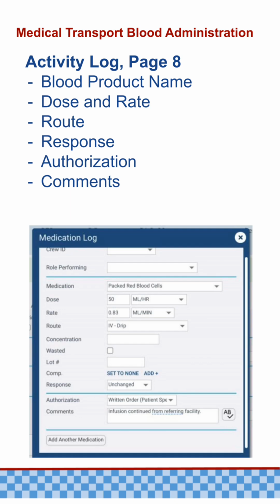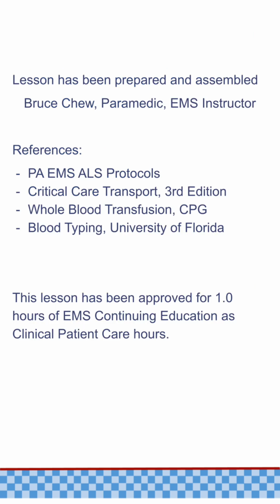In the authorization field, you should document written order, patient-specific. Finally, in the comments section, write a statement that the infusion was initiated at the referring facility and continued during transport. Thank you for this KQT Health Learning Management System lesson on blood product administration for medical transport.